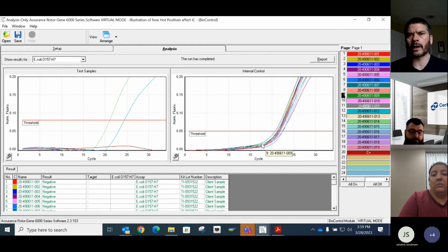The reason R&D designed the assay that way is we did not want the amplification to start occurring early on in the run, because remember earlier when I talked about plateauing of the lines, the reason is because you run out of reagents. So we don't want the internal control, yes, it's a different segment of DNA, of course.